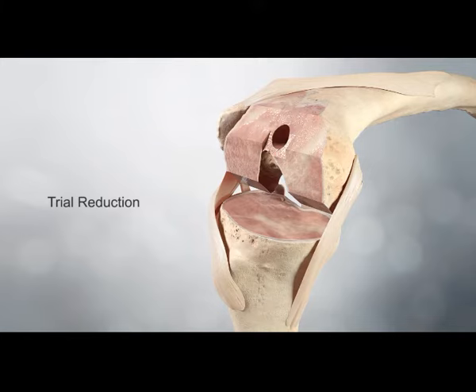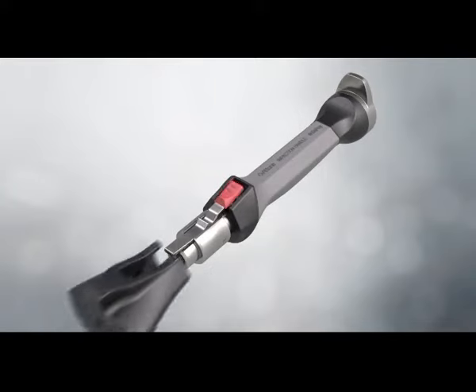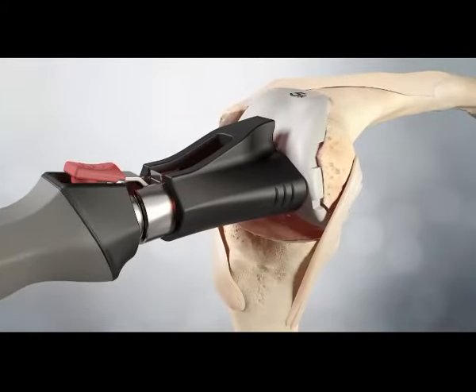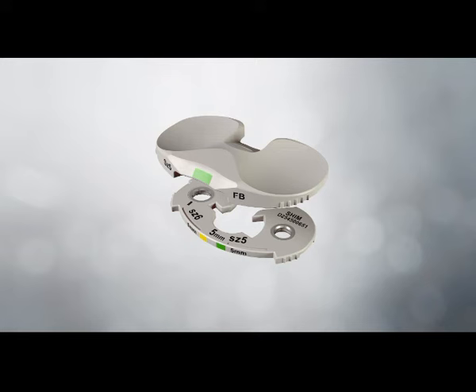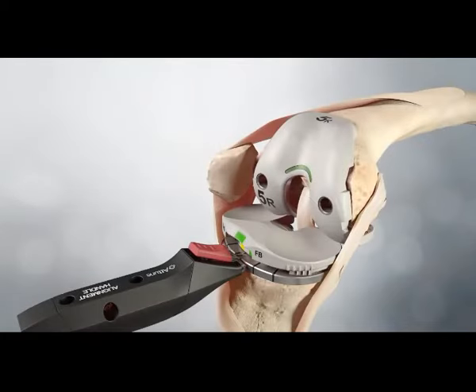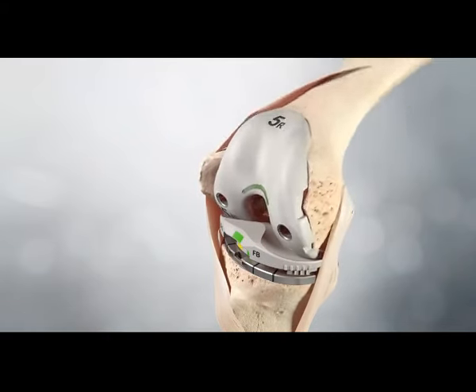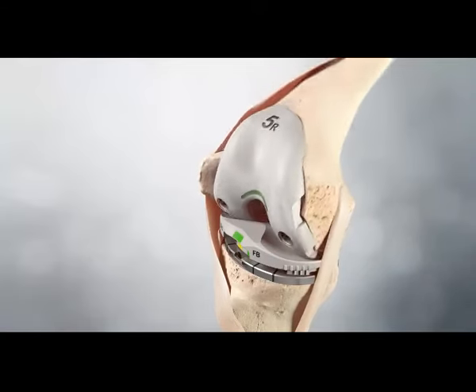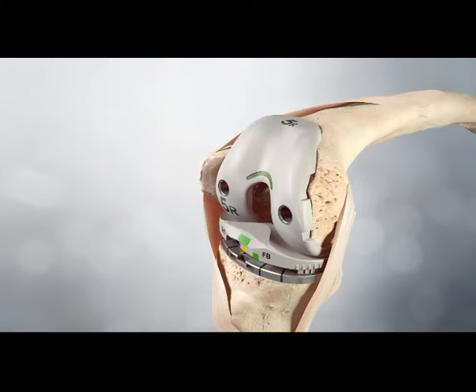Trial reduction. The femoral trial is positioned on the femur; the femoral impactor can be used to fully seat the trial. If the trial does not fit, the cuts should be revisited. The tibial articulation surface trial is selected to match the femoral size and style of implant along with the corresponding shim. The articulation surface trial and shim are securely engaged and the assembly attached into the base trial. With the trial prosthesis in place, the knee is extended carefully, noting the antero-posterior and medial lateral stability and the overall alignment. Any instability can be corrected using the next thicker shim. The femoral lug holes are drilled using the patella femoral drill.